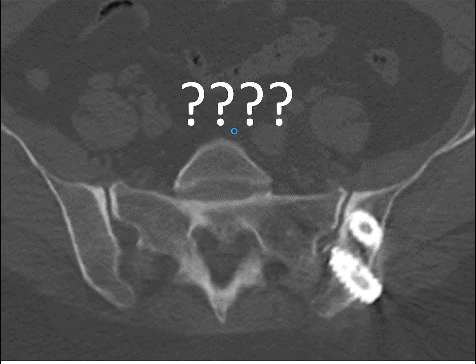So I don't think I've been comparing this as like all diarthrodial joints are the same. This one has a different personality than the knee. There's a lot more motion there. But I think you could take the screws out. I think you could tell them, I think you're still going to hurt it, but part of your problem is these screws working around your joint.